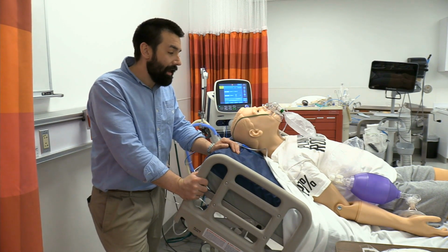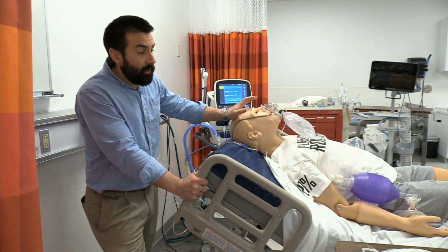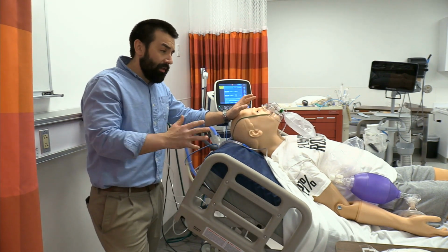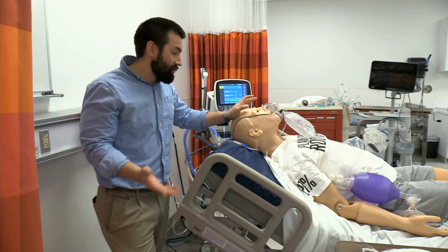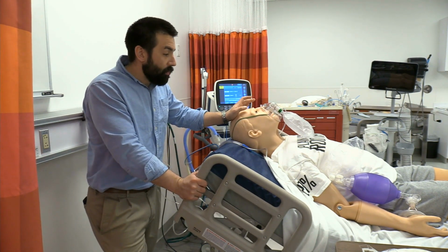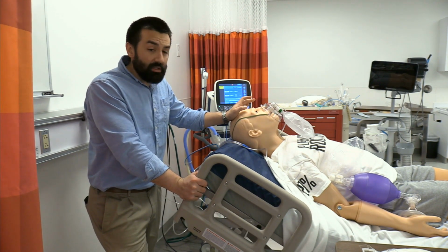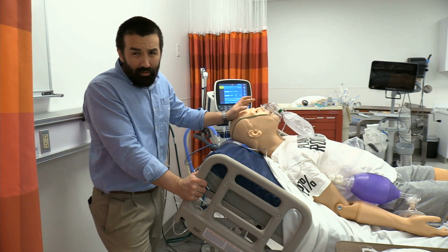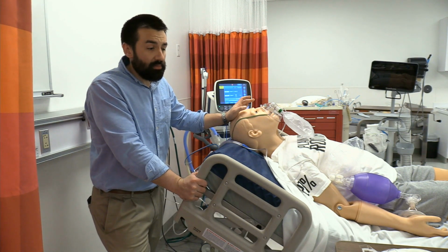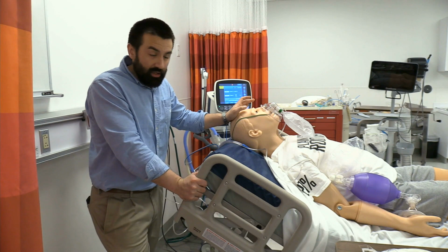associated with RSI. Now, there are some exclusion criteria when you wouldn't be able to use this non-rebreather and we would have to utilize manual resuscitation. Obviously, if this guy doesn't have a stable ventilatory drive, so ineffective ventilation, not ventilated at all, or if we couldn't get his oxygen saturations up appropriately, well above 90%, we'd have no choice but to provide manual resuscitation. Sometimes if you already have an OptiFlow in the room or a non-invasive ventilator, something like that, we can utilize that as a pre-oxygenation device. We just wouldn't go through all that trouble and grab that just for this particular process.